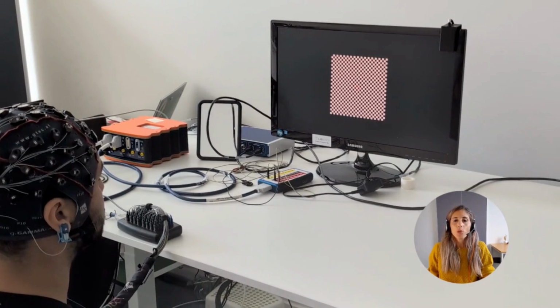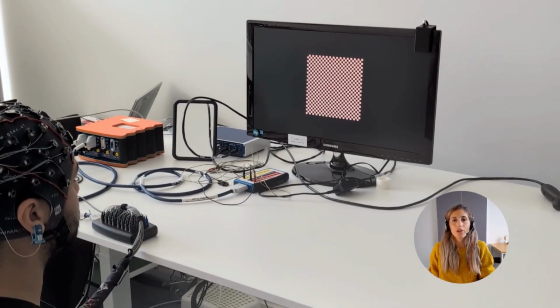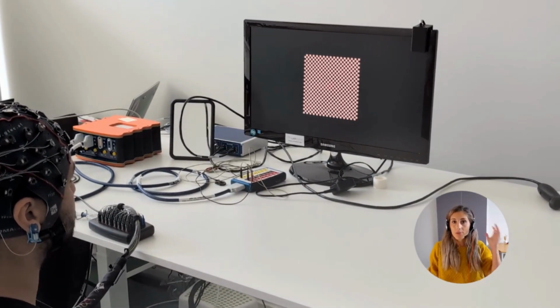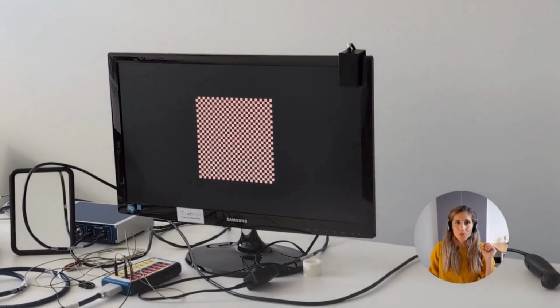During a visual evoked potential test, the participant sits comfortably looking at a screen where they are shown some flashes or checkerboard patterns. The electrodes that we are interested in are in the occipital lobe, as mentioned, especially OZ, O1, and O2.